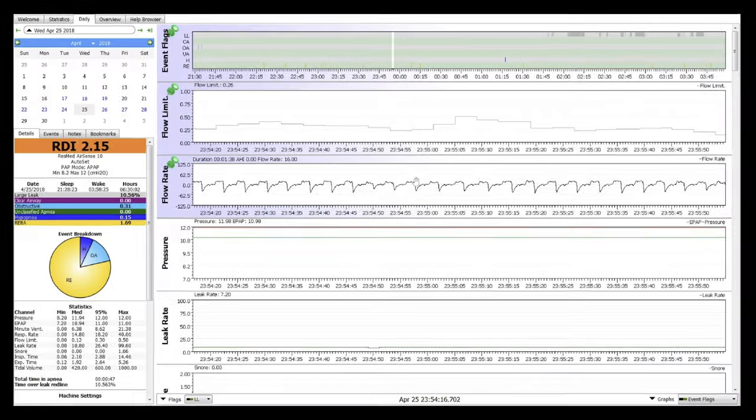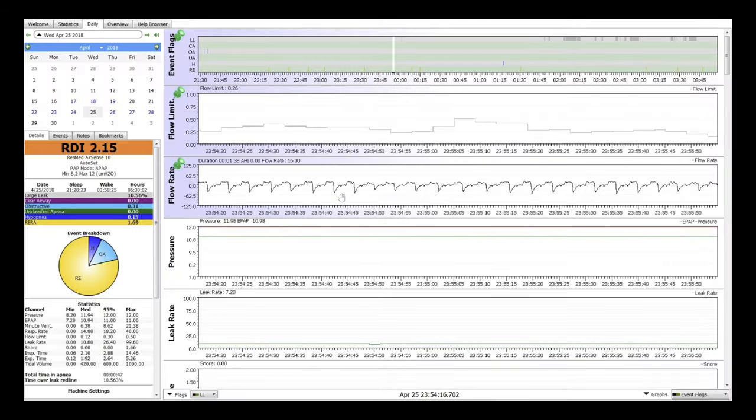Now, I just want to show you a few flow limit graphs of patients that turned on pressure support or turned on EPR or increased either of those. So here's with no EPR, as you can see, there's a considerable amount of flow limitation throughout the entire night. And then here's that same patient with EPR on three. You can see the flow limitation is drastically reduced and this is consistent across nights as well.